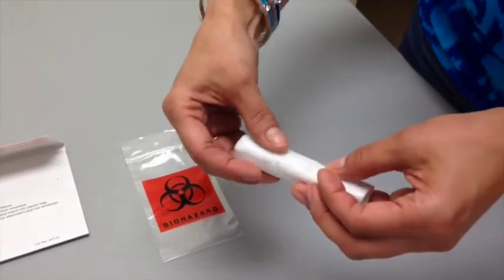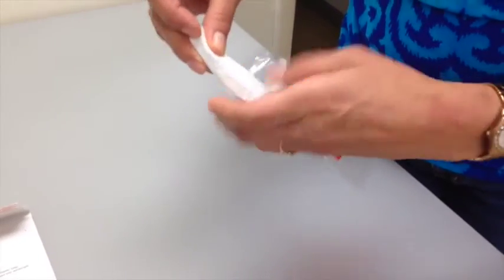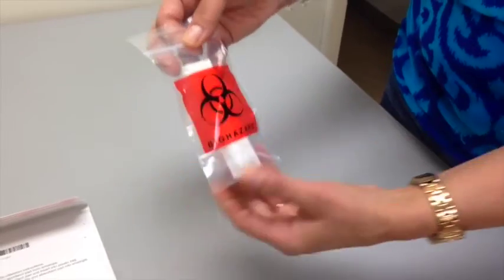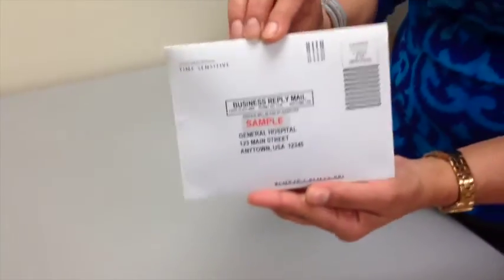Wrap the sampling bottle in the absorbent pad and place in the biohazard bag. Seal the biohazard bag. Place the bag in the cardboard return mailer. Seal the return mailer and place in the U.S. mail within 24 hours of sample collection. Thank you for choosing OC AutoFit.